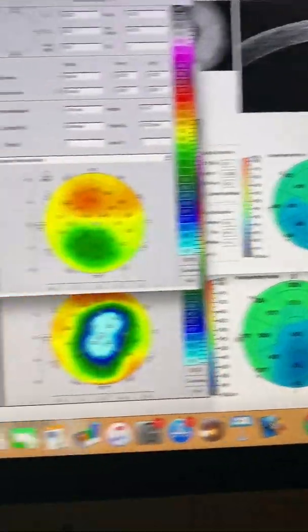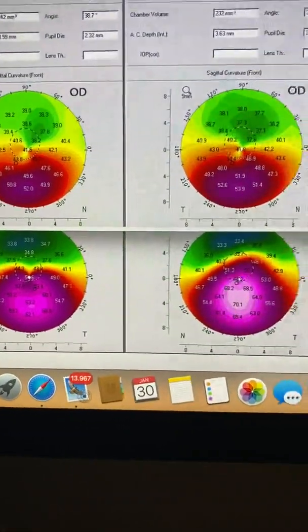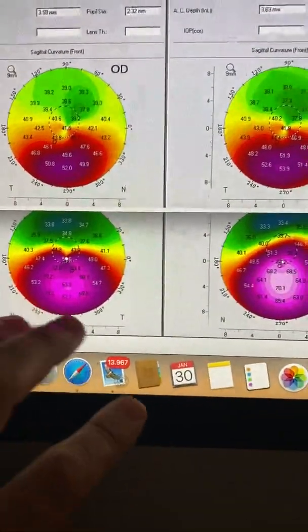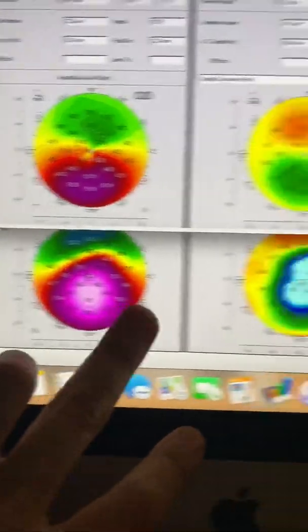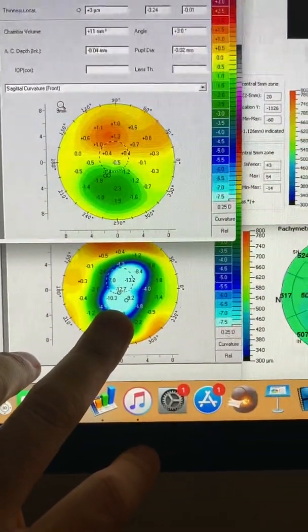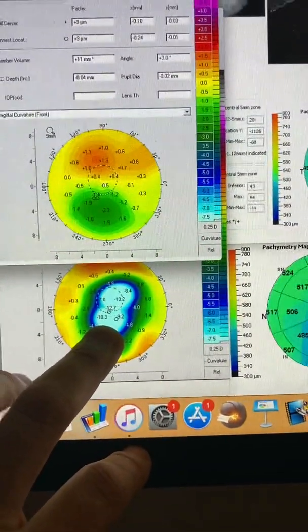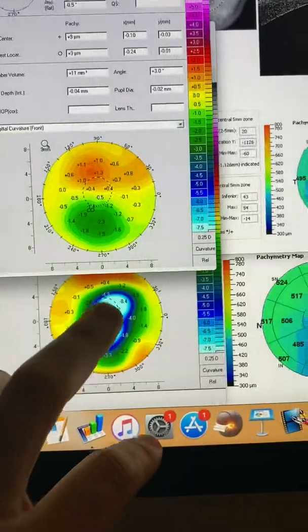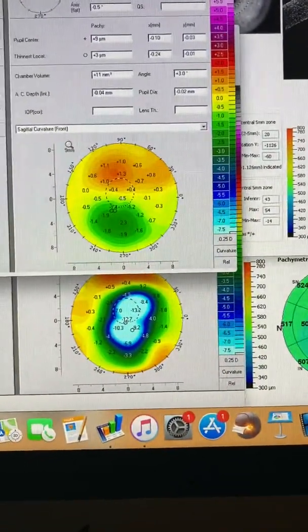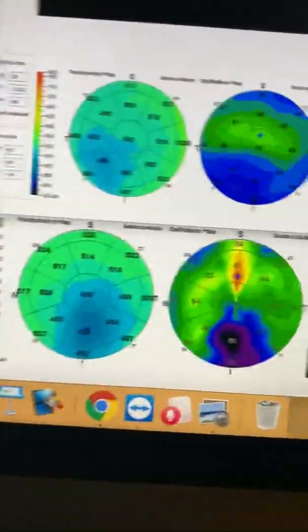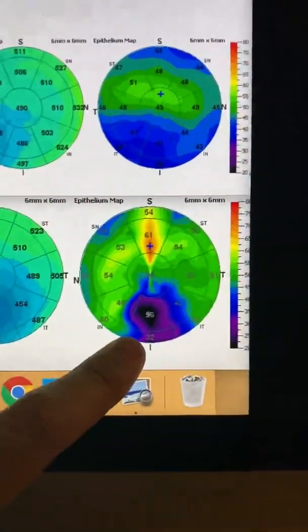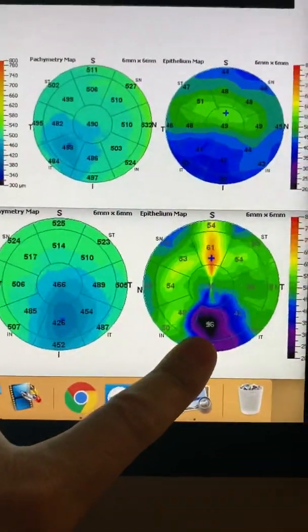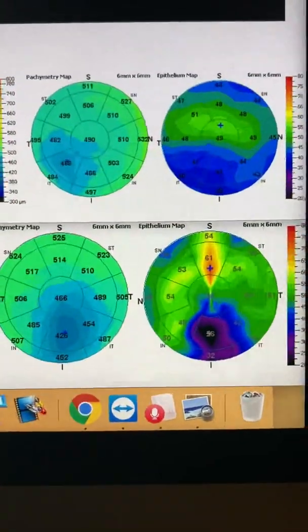And these parameters are even more prominent in the left eye. We have an almost 10-diopter change here, 10.3-diopter steepening of the cone area, and significant flattening in the area around the cone. The cone on the left eye is more central, and the epithelial changes are even more prominent on the left eye over the cone area.